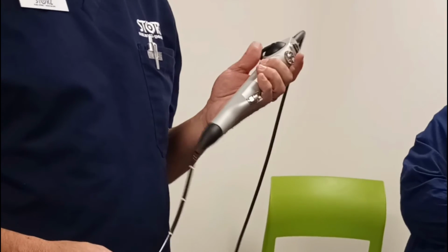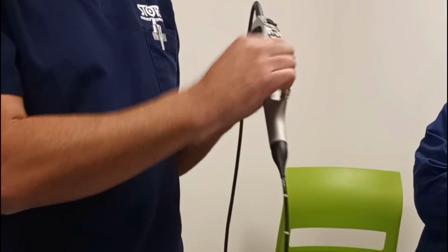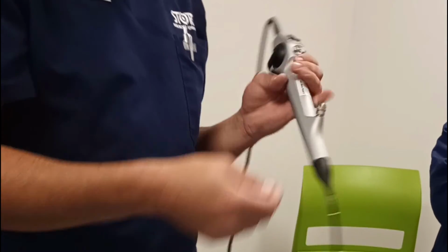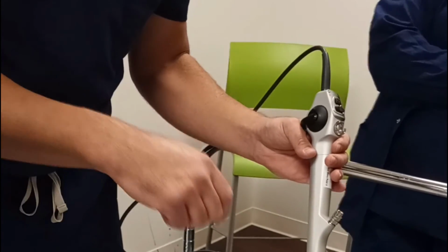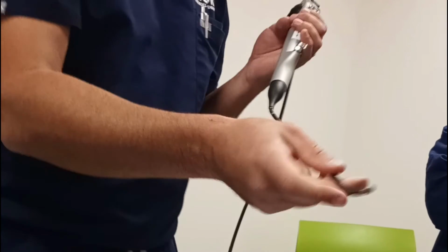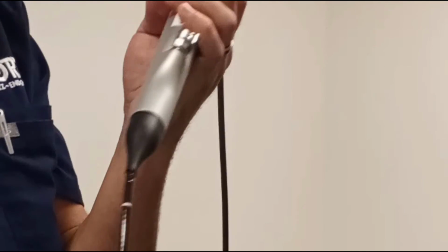All right? So now we have your detachments, right? You have your attachments with the green port and all that stuff. You're going to take your syringe. You're going to draw enzymatic up through the 60 cc syringe, and you're going to attach it to the scope. You're going to take your distal tip, place it in an empty basin or an empty sink, and you're going to flush enzymatic fluid through the shaft of the scope into an empty sink.